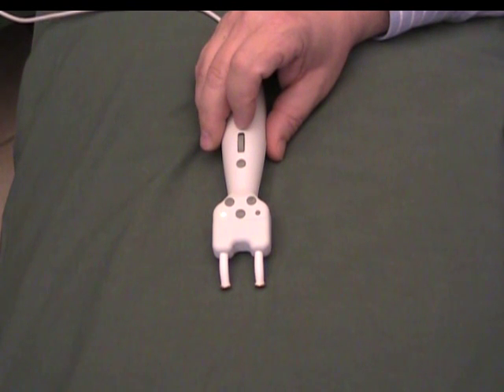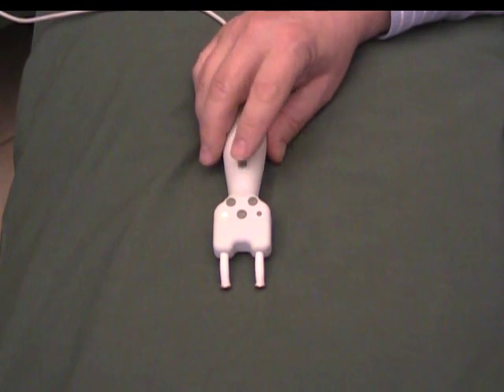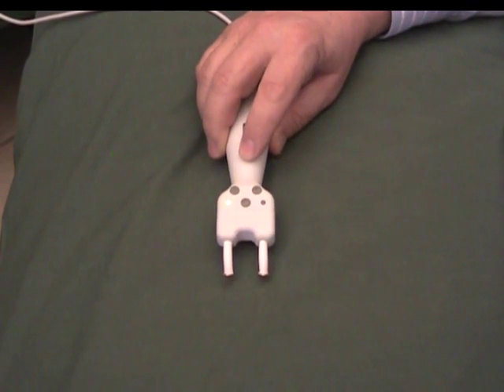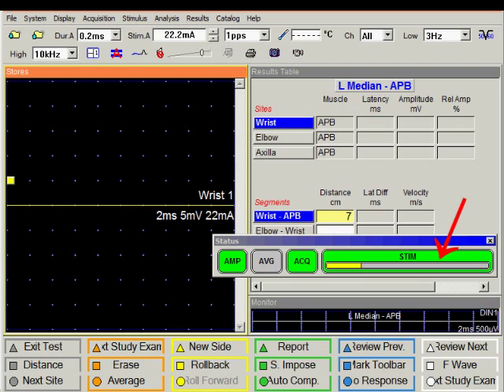The button right above the stimulus dial activates the stimulus. It is the single stimulus when pressed and released.